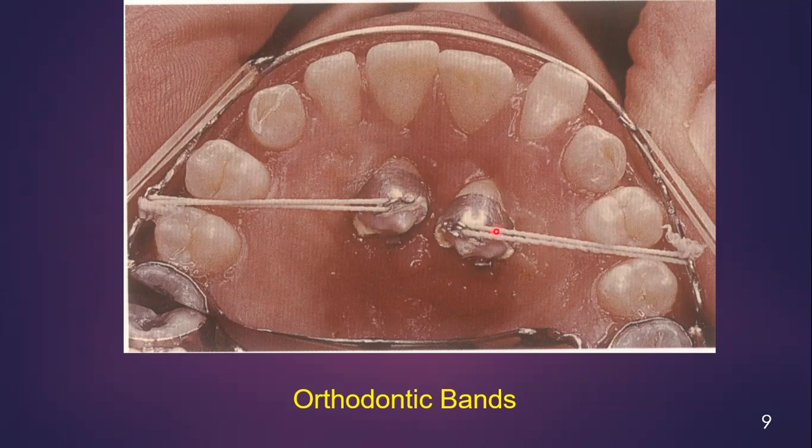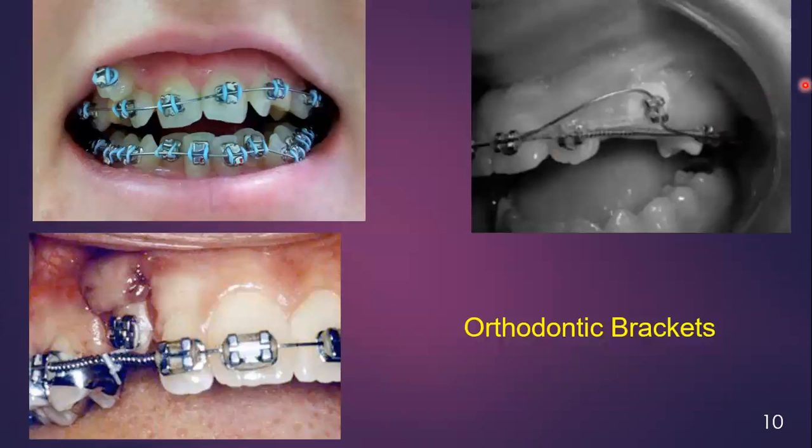Now impacted canine, you can see here. Orthodontic brackets, most commonly used. Here you can see, and then you will apply a traction to attach it with the arch wire.